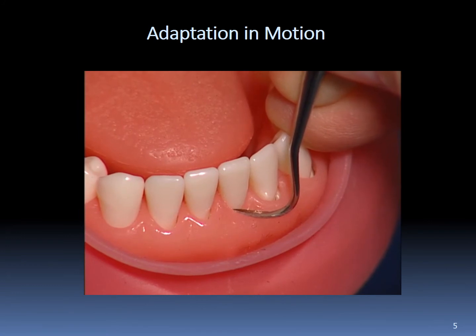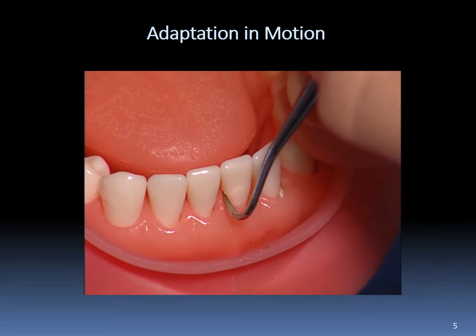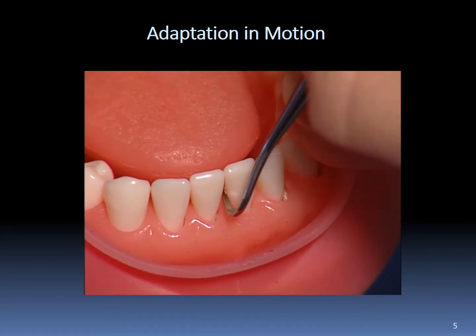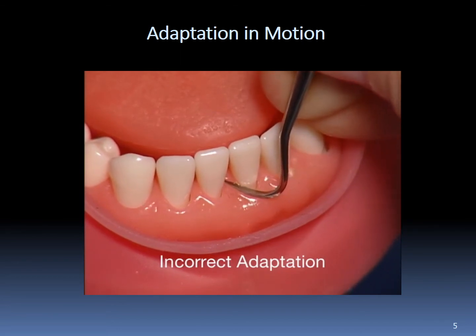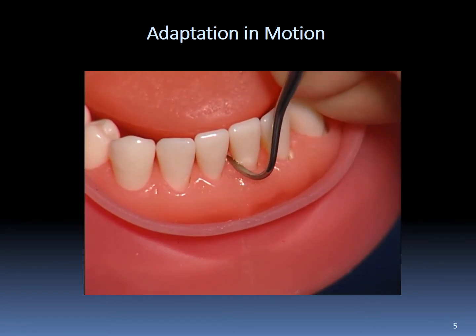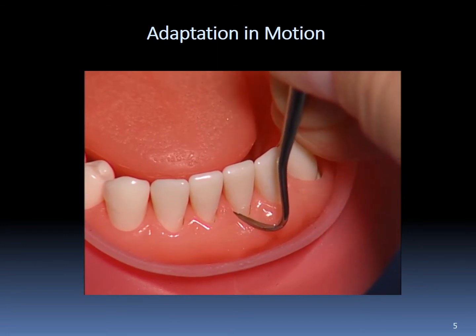As the working end moves around the surface of the tooth, it is necessary to turn the handle to maintain correct adaptation. As the working end moves onto the mesial surface, correct adaptation involves keeping the tip third of the working end in contact with the line angle of the tooth. Now, adapt the middle third of the working end to the mesiofacial line angle. Adapting the middle third is a common instrumentation error when moving the working end from the facial to the mesial or distal surface. Can you see why it is vital to always keep the tip third of the sickle scaler in contact with the tooth surface? In summary, to avoid trauma to the gingival tissue, it is important always to keep the leading third of the instrument in contact with the tooth surface.